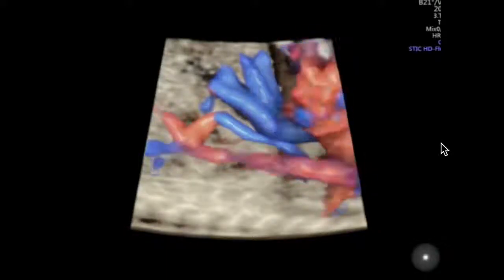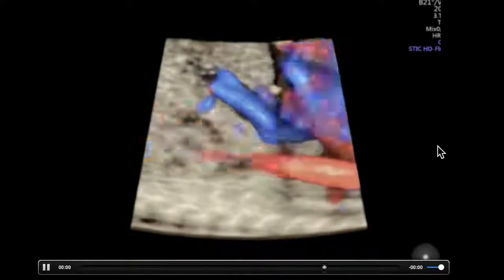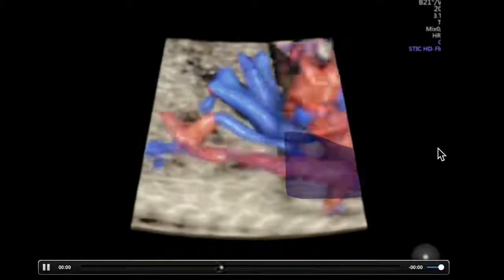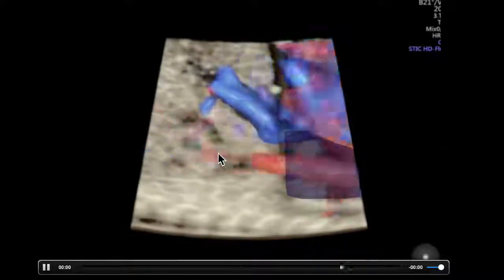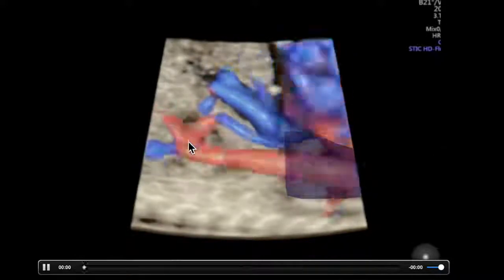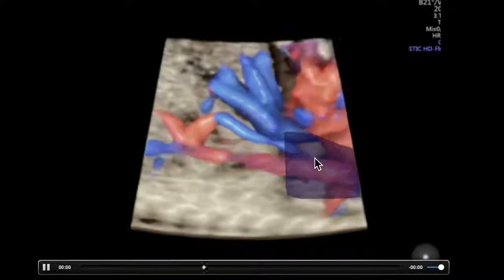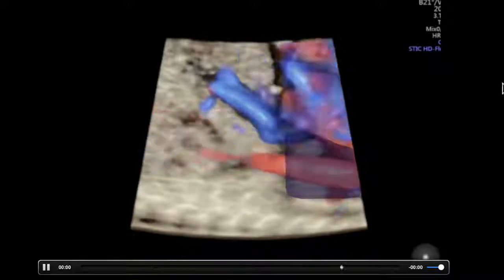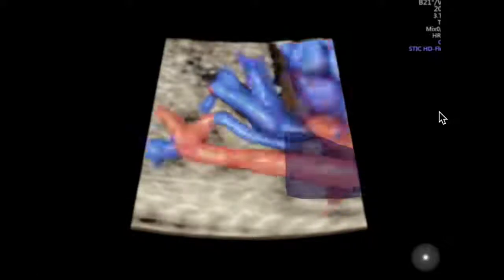Looking at vasculature elsewhere in the abdomen, this is a case of a fetus who actually had a left lower lobe lung mass. And I'm sure all of you know at that point you really start to assess where the vasculature to a lung mass comes. Is it systemic or pulmonary? And in this case, this is a systemic vessel coming off the celiac trunk that pierces the diaphragm and feeds the mass. Now, what we're able to see with grayscale is really the proof that this vessel traverses the diaphragm. You wouldn't know where the diaphragm is without the addition of the glass body.